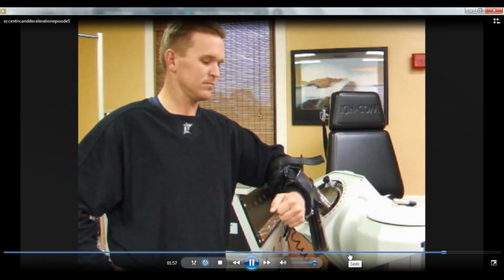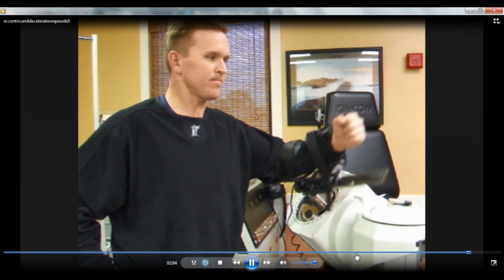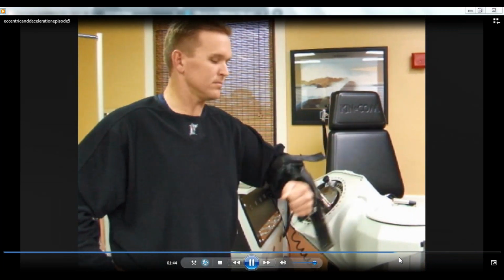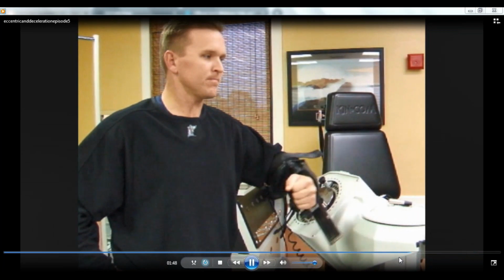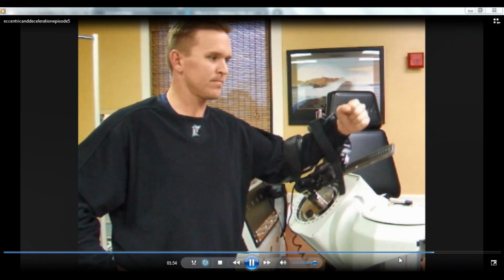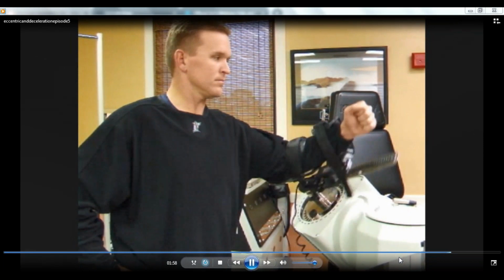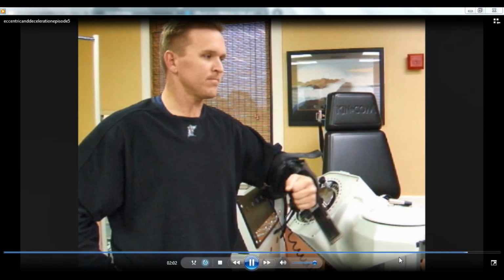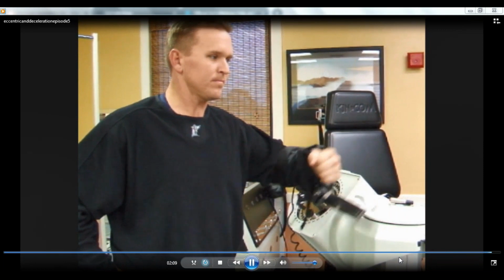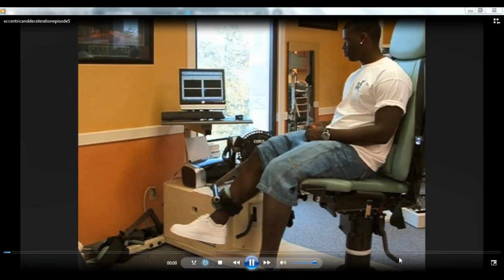So we increase the speed in the eccentric mode faster than the concentric mode. And again, this is something that I want you to really go over. Here's one of our professional pitchers, and we're taking him through a rotator cuff deceleration program. So 60-degree range of motion at 60 degrees concentrically, 120 degrees eccentrically, it's a half a second. Now, imagine if I took him up to 240, which I have done, at a quarter of a second, it's half that time. If we look at him perform this, it's one second up, a half a second on the way down. Now imagine he's coming down twice as fast at 240 degrees. It's a very high speed deceleration.